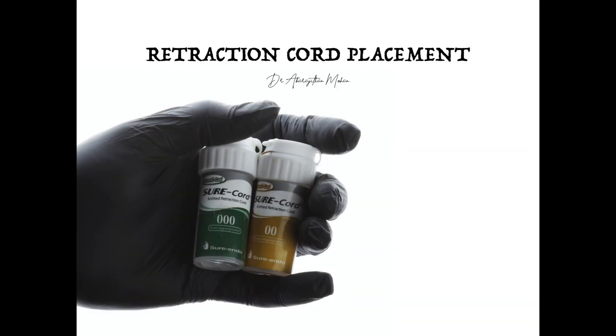Hello friends, welcome to Endo Tales from Life. In this video we are going to do a simple demonstration of retraction cord placement before tooth preparation.